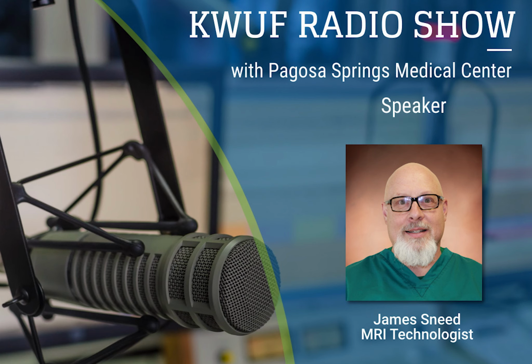Yeah. And you said without radiation, which is... There is no radiation on MRI machines, and there are no side effects as far as we know. However, we are looking for pacemakers, because the scanner can turn them off. And we're also looking for hearing aids. We don't want any hearing aids in the scanner. They have a magnetic driver, and the magnet will lock it up, and they just won't work, and they're expensive. So don't bring your hearing aids to the scanner.